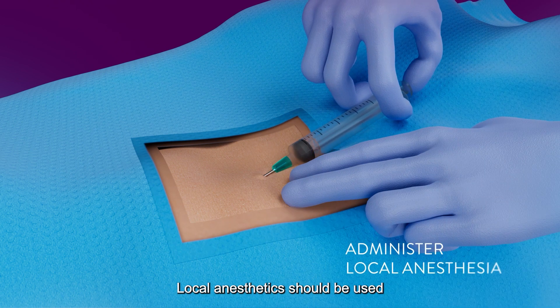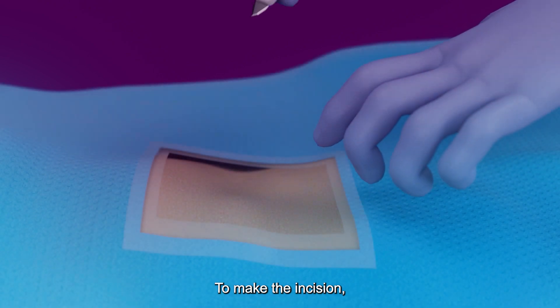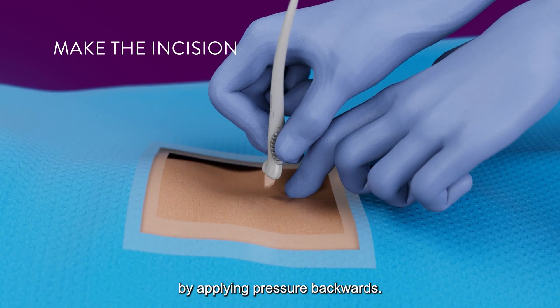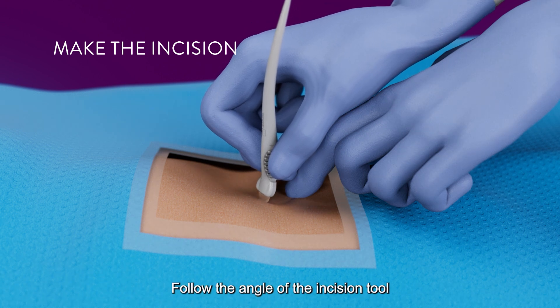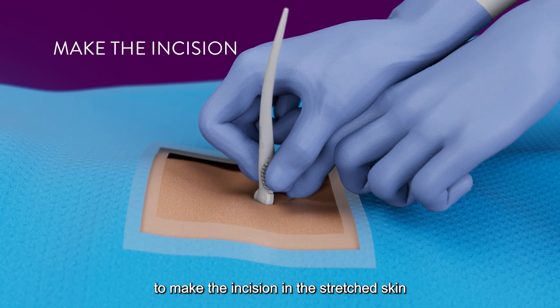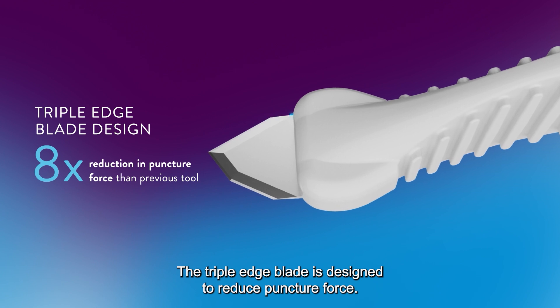Local anesthetics should be used prior to inserting the ICM. To make the incision, use a finger to stretch the patient's skin by applying pressure backwards. Follow the angle of the incision tool to make the incision in the stretched skin directly in front of the finger holding it. The triple-edge blade is designed to reduce puncture force.